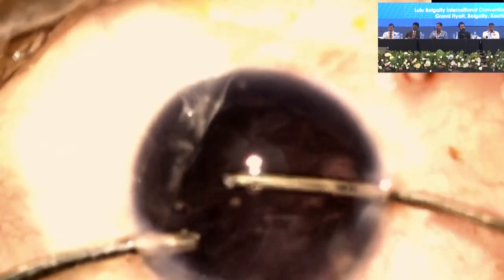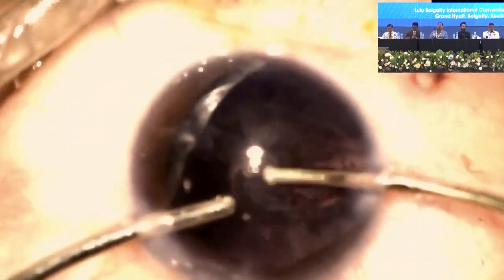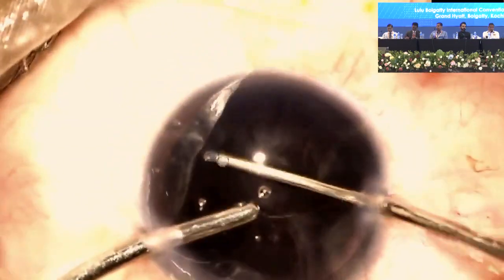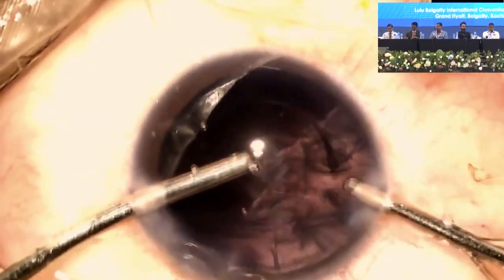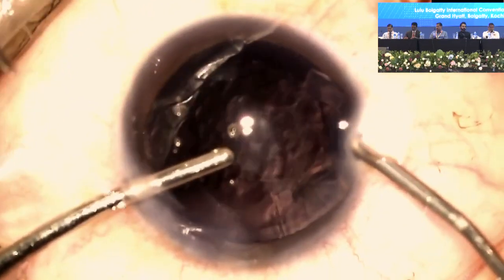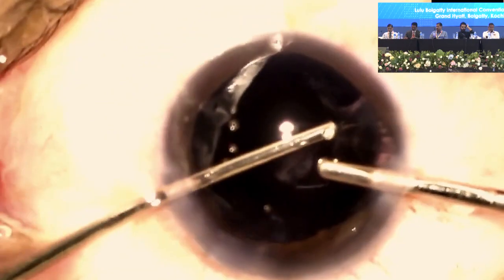During irrigation aspiration, you need to take utmost care when you're actually pulling on the cortex in the area of the torn anterior capsule, because you don't want to accidentally hold on to that anterior capsule, because that could result either in the extension of the tear or in a zonular dialysis. It is imperative to perform a viscofluid exchange before swapping hands during irrigation aspiration. The remaining cortex is removed with care and caution.